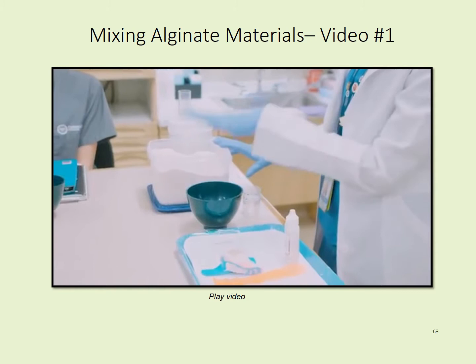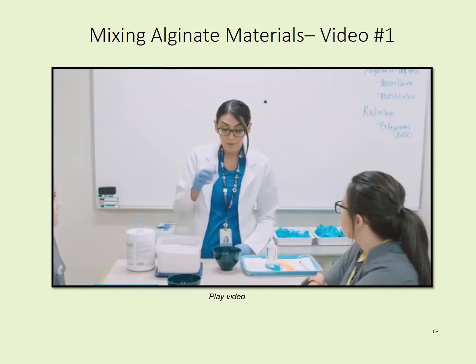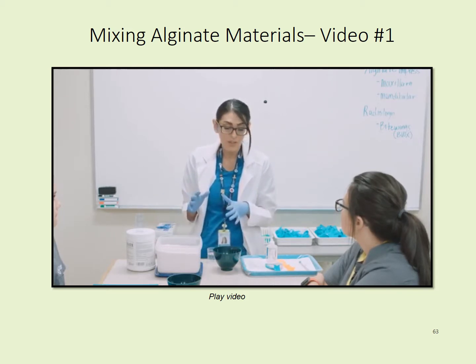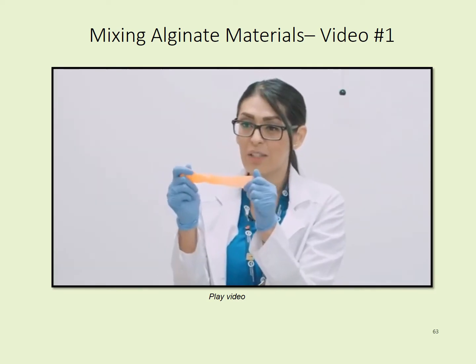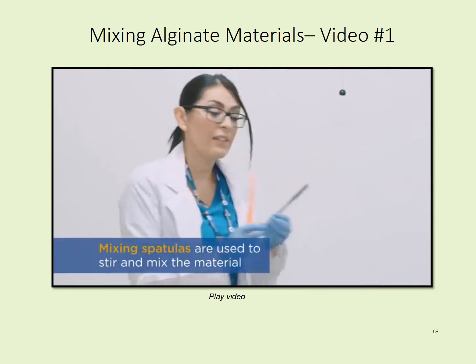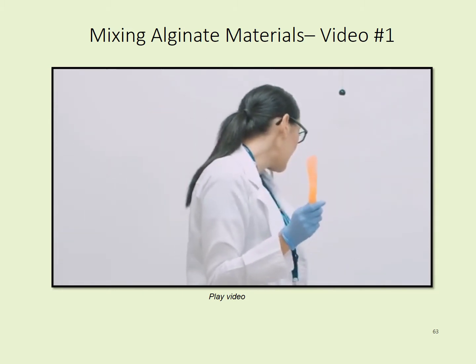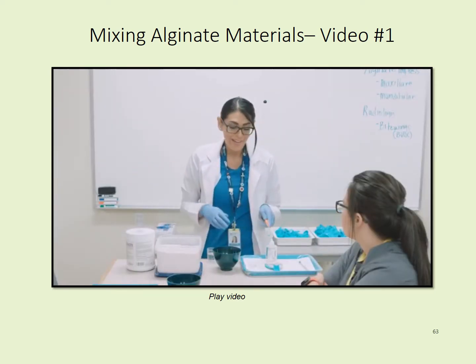So now that we have our mixing bowl, we have our alginate impressions, and we have our cup filled with our cool water, we are going to get the measurements ready for our alginate impression. Now, this little guy right here is a mixing spatula. Mixing spatulas can be plastic. They can even be metal. And this particular one is plastic and it smells like orange for the sake of the patient.